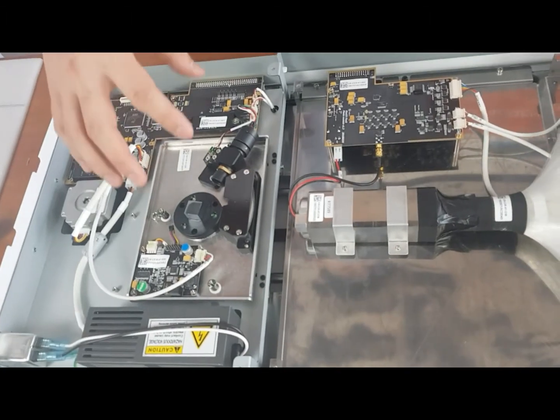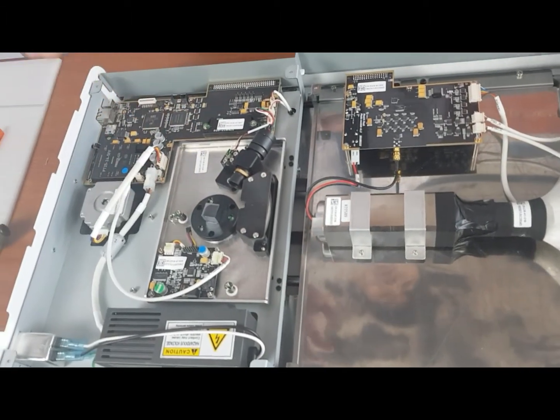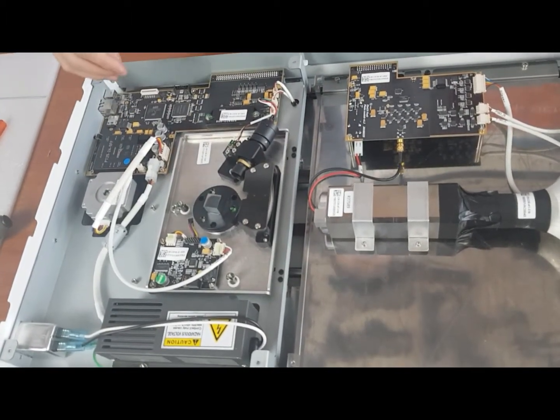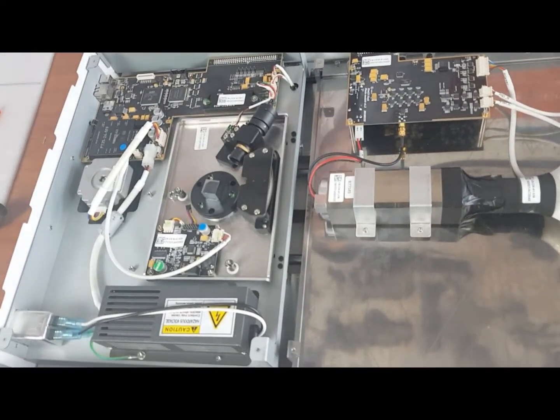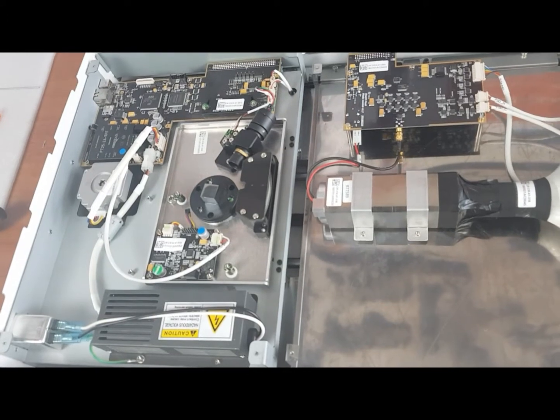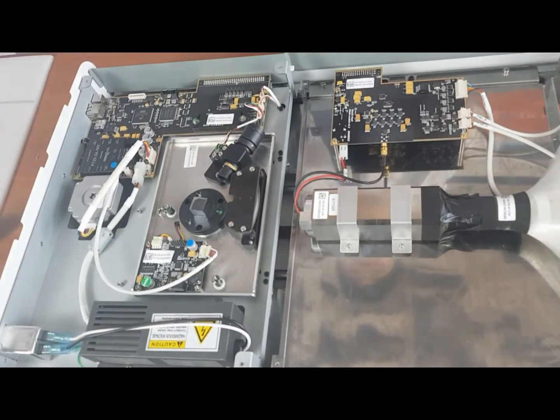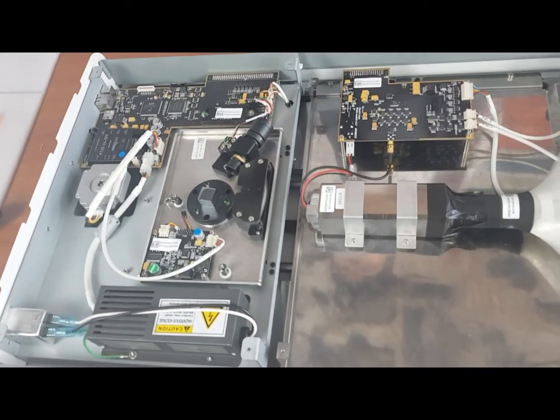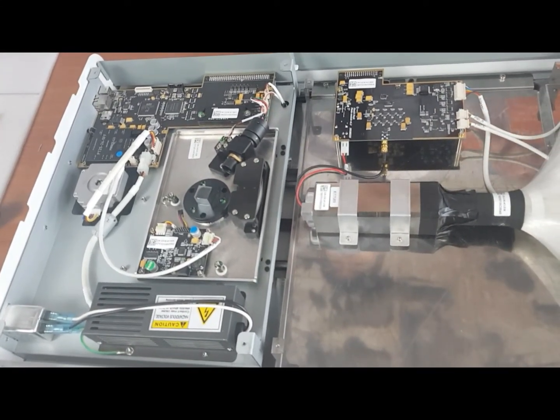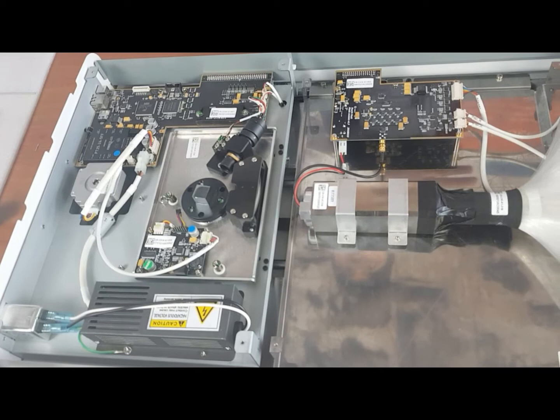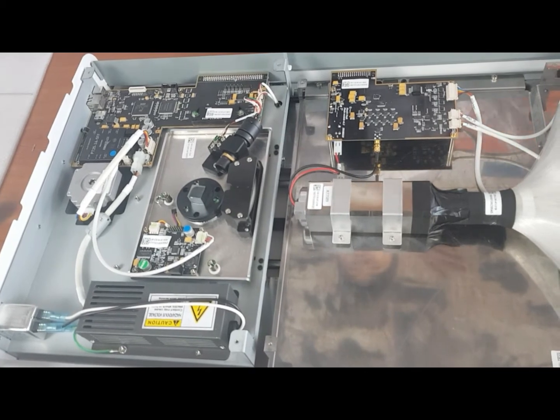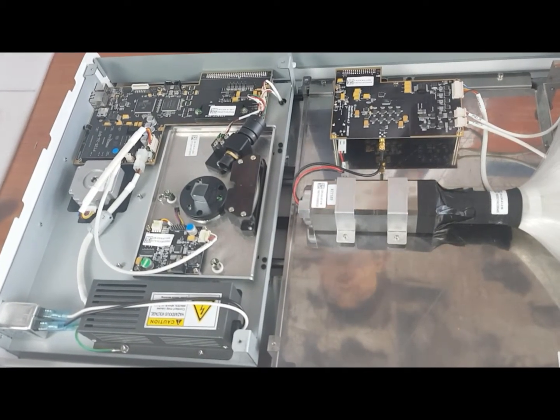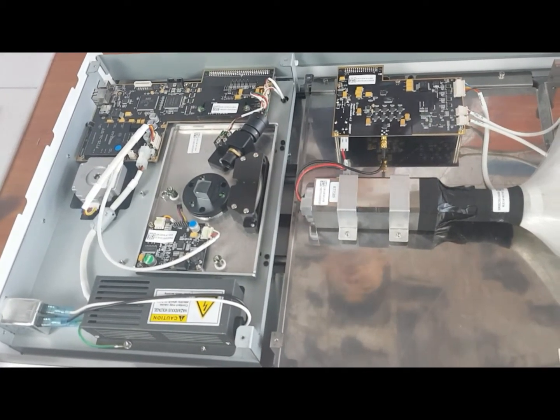You first have to disassemble the octiplate and the mainboard. I already showed you guys how to do that in my other two videos, so please watch them before proceeding with this current video.